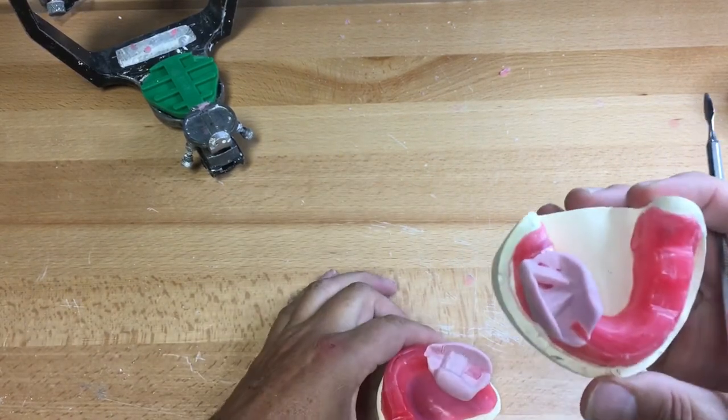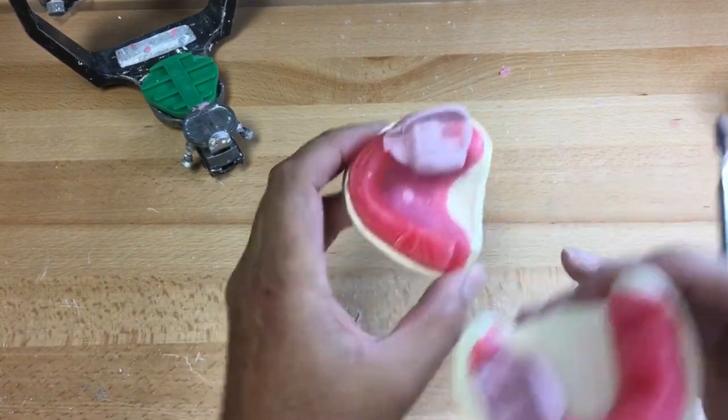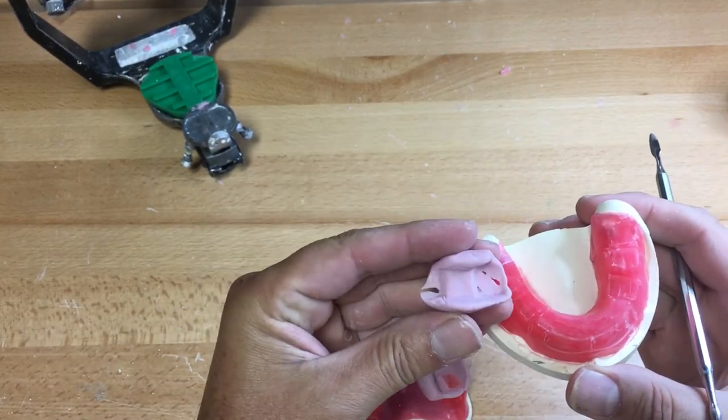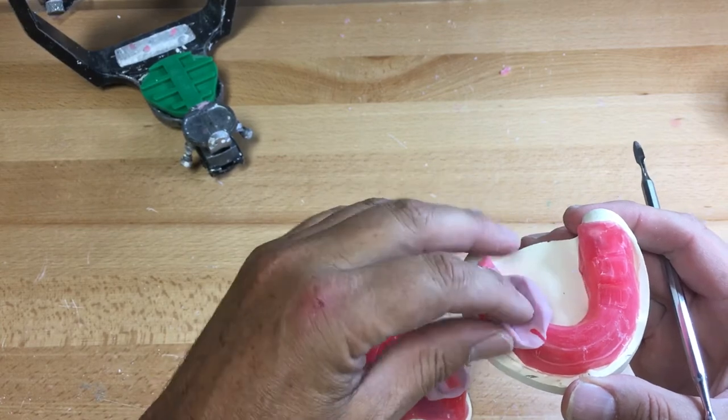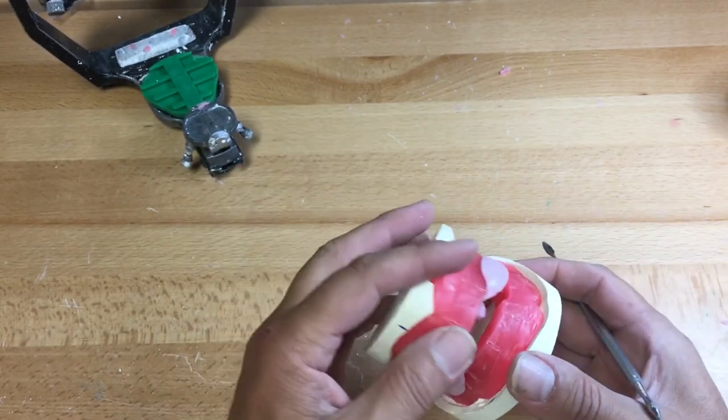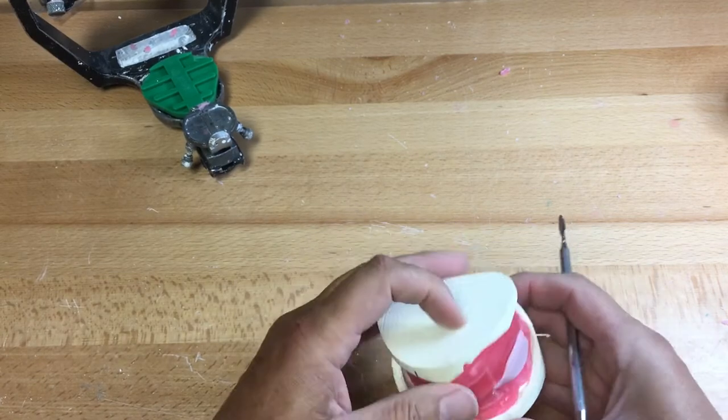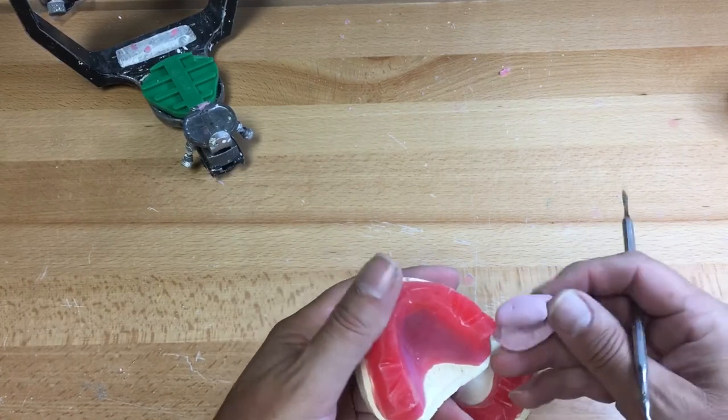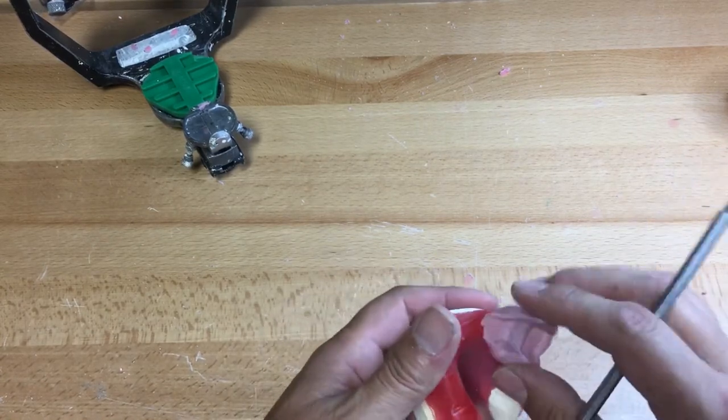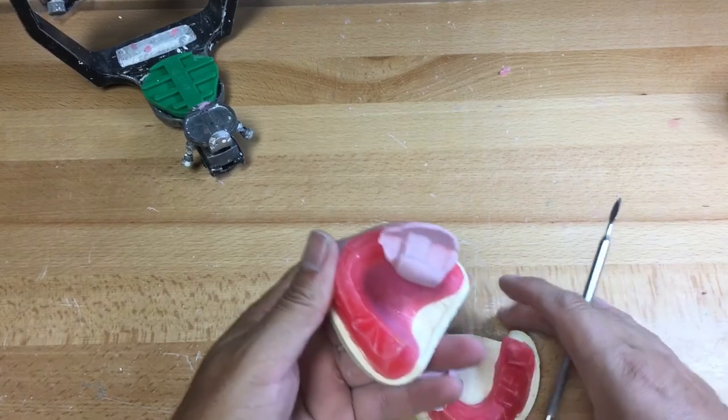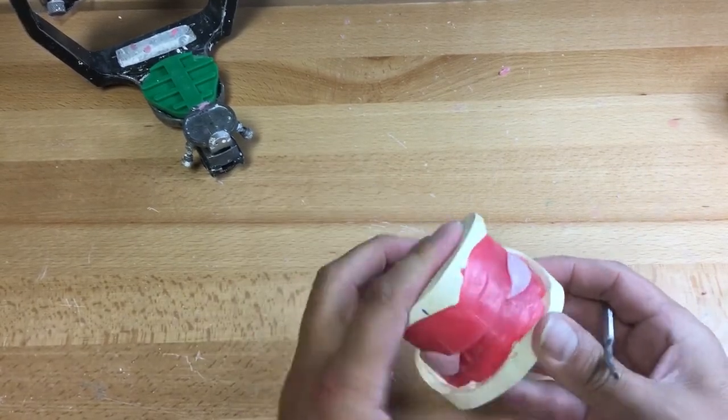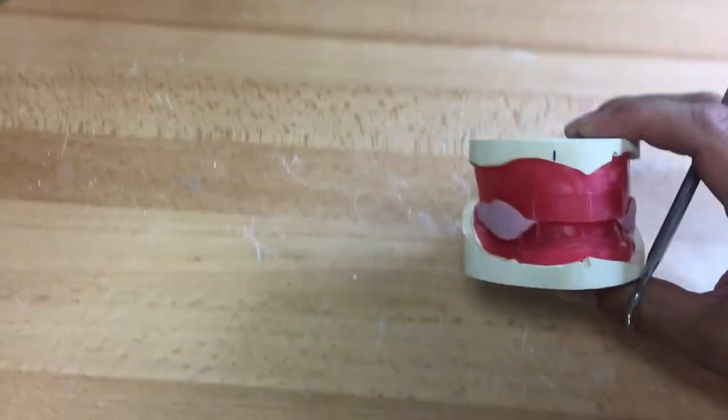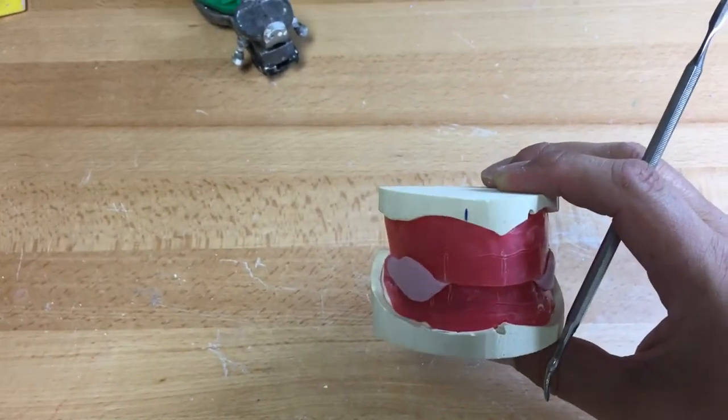As you can see here on my occlusion rims, there's a four millimeter roughly line behind the canine lines. So I'll have the client move their mandible forward until this line meets this line. Then I know they've moved protrusive enough. I don't want it to come all the way around where the condyle will slip outside the articular eminence.